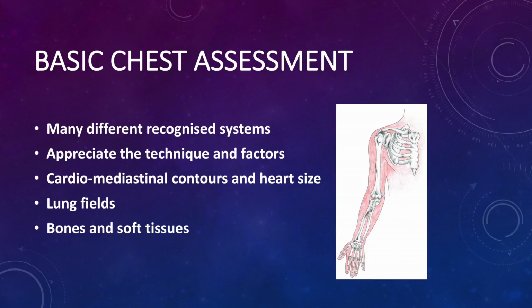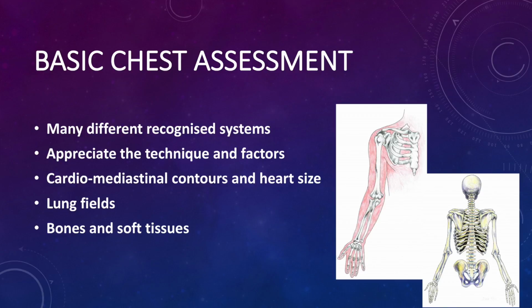So I've put together some basic thoughts, really, things for you to keep in mind when you're reporting your MSK films. Don't disregard the chest. We had a case in a hospital recently in the last 6 weeks where we had a beautiful report on a thoracic spine that was absolutely on the money, perfect, but didn't mention the large lung tumour that was sat there visible on both views. They'd just gone into MSK mode, and the clinical history completely led them down the garden path, and that's the danger. So always appreciate the lung fields, have a good think about them.